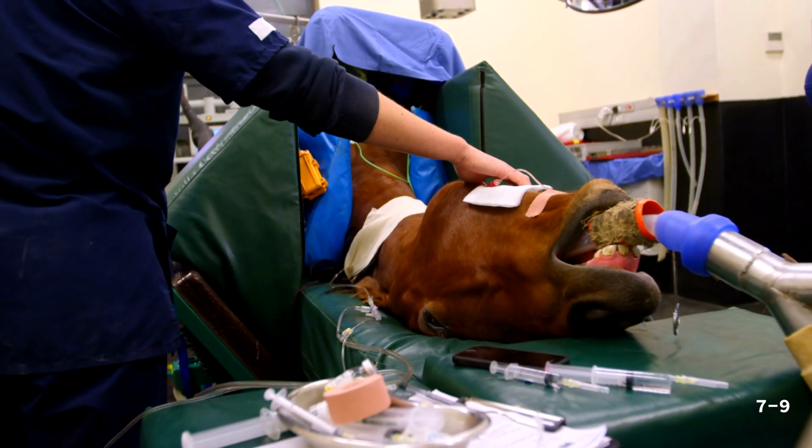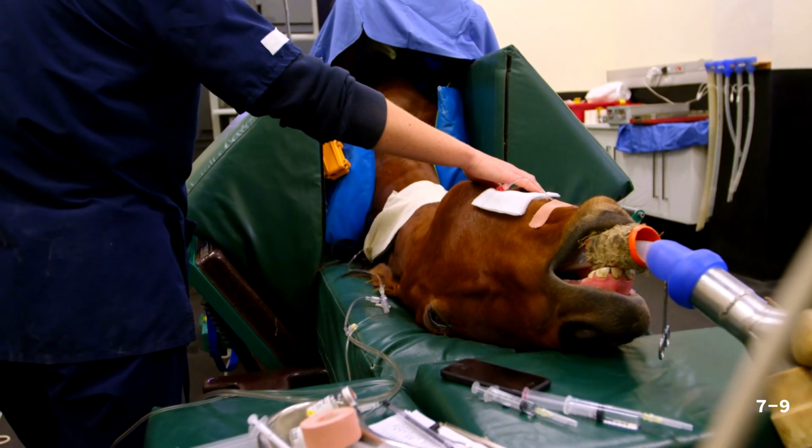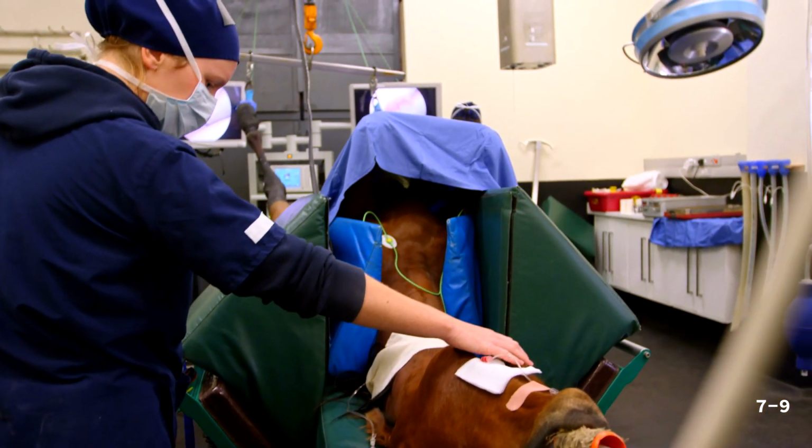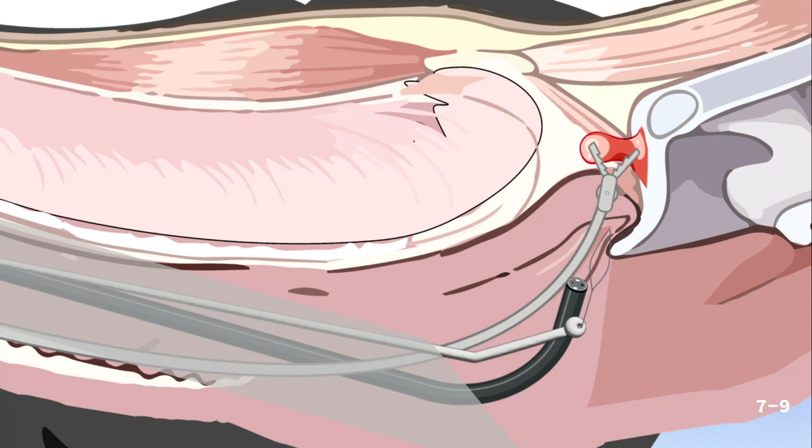The oral approach in dorsal recumbency is a minimally invasive technique commonly used for the removal of small subepiglottic cysts. It offers the advantage of maintaining the cyst in a position above the palate for easy manipulation and excision.